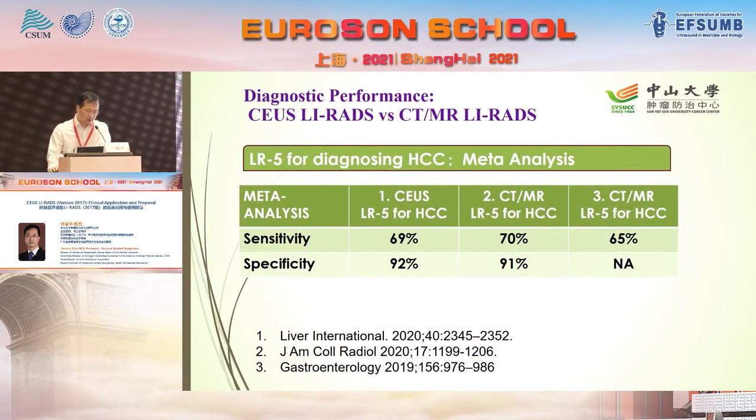We did a meta-analysis from newly published 3 studies showing the pooled proportion of sensitivity and specificity of CEUS LI-RADS for diagnosing HCC when using the LR5 criteria. There was no significant difference in the sensitivity and specificity between CEUS and CT/MRI LI-RADS.